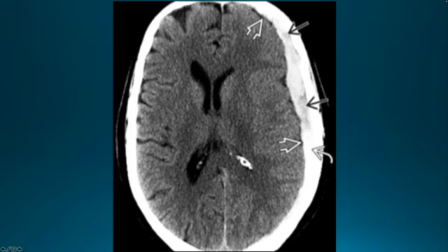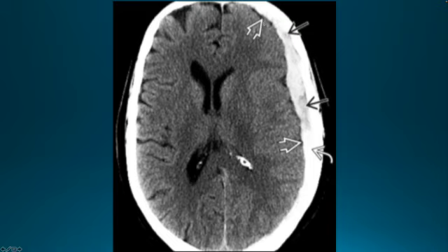The first thing I want you to notice is that there is a hyperdense, crescent-shaped, extra-axial collection that extends along the convexity overlying the left frontal lobe and portions of the left parietal lobe. It's outside the brain, inside the skull, and it's basically delineated on its inner aspect by these white arrowheads and at its outer aspect by the black arrows. You can see that that collection is resulting in some mass effect intracranially.